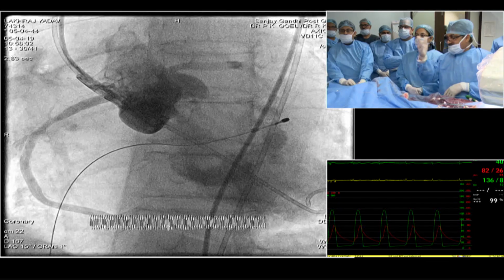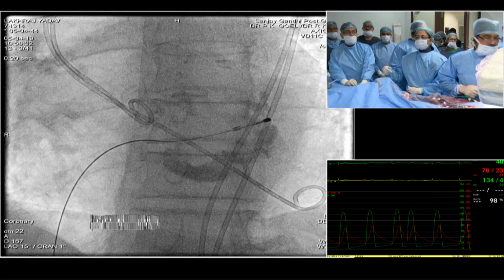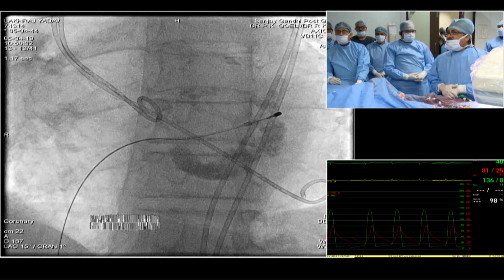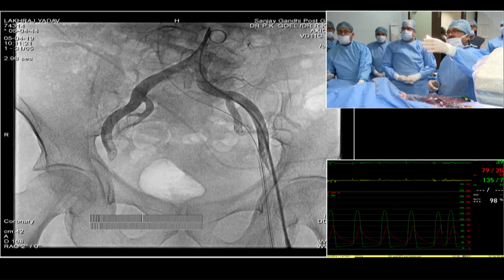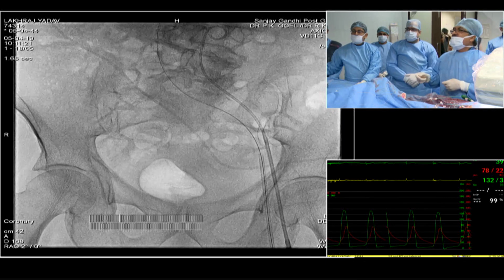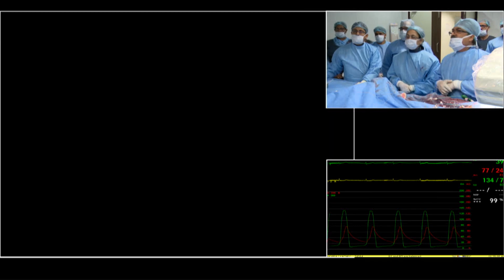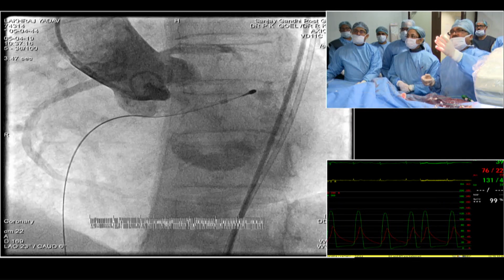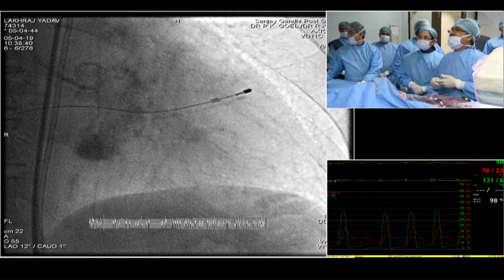So I'll just show you now the current pictures where we are. Next, can I see the live angios, please? The ones that we have just done. So that's the angio at the bottom. That's the peripheral angio. The division was low, so we could puncture reasonably okay. Next, please. So that was the basal angio. This was actually in the right sinus. Can we see the next one?